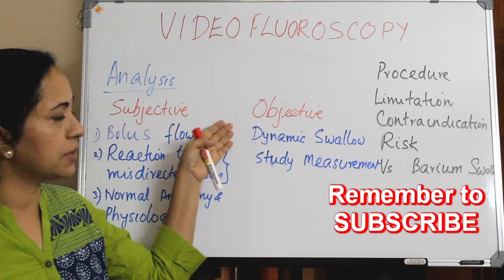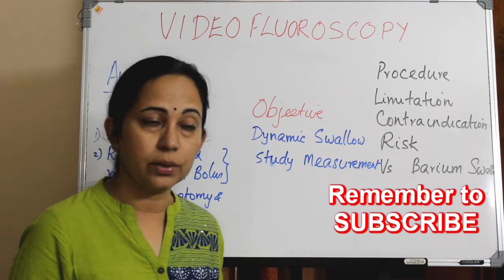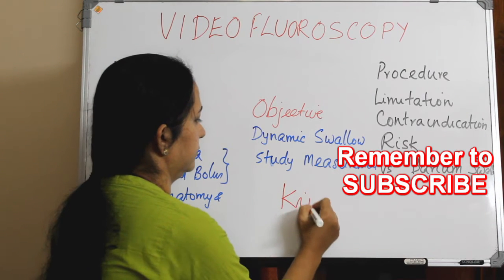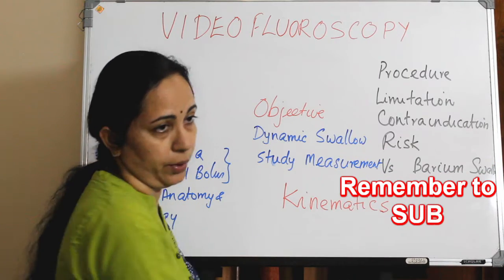The objective analysis is on dynamic swallow study measurement, or kinematics of swallowing.